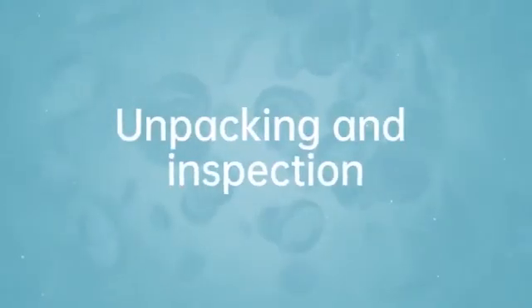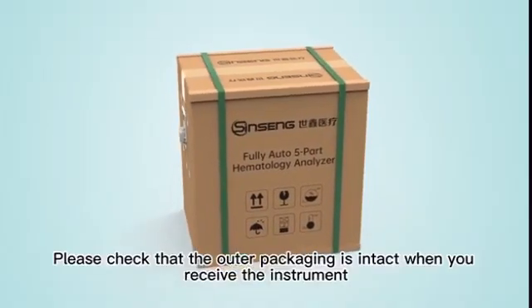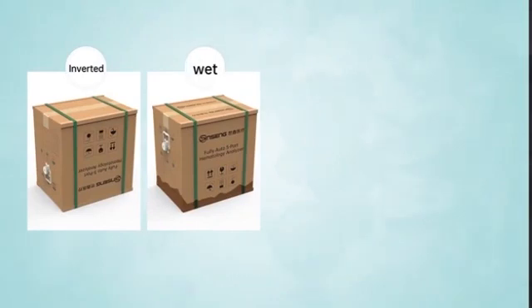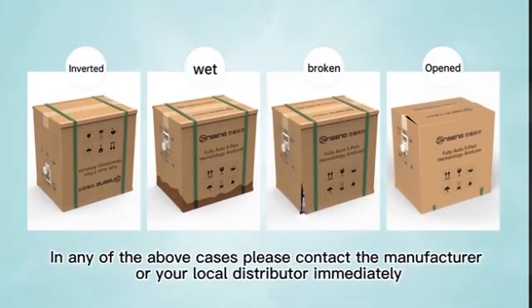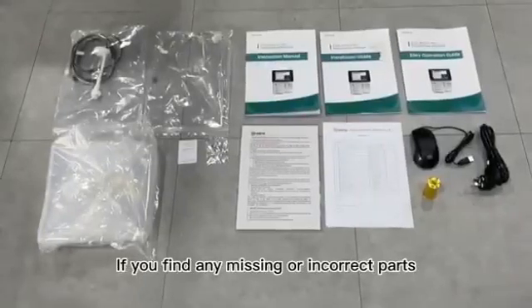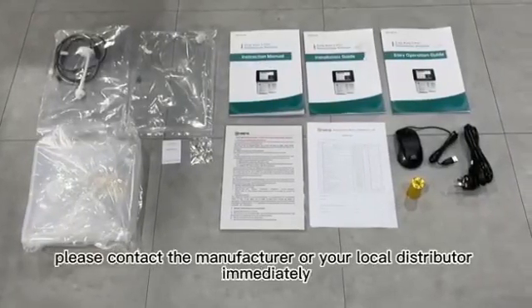4. Unpacking and Inspection. Please check that the outer packaging is intact when you receive the instrument. If the outer packaging is upside down or deformed, there are obvious signs of wet water, obvious signs of impact, or signs of having been opened, please contact the manufacturer or your local distributor immediately. 6. Unpack the outer packaging and check the accessories against the packing list inside the packaging. If you find any missing or incorrect parts, please contact the manufacturer or your local distributor immediately.